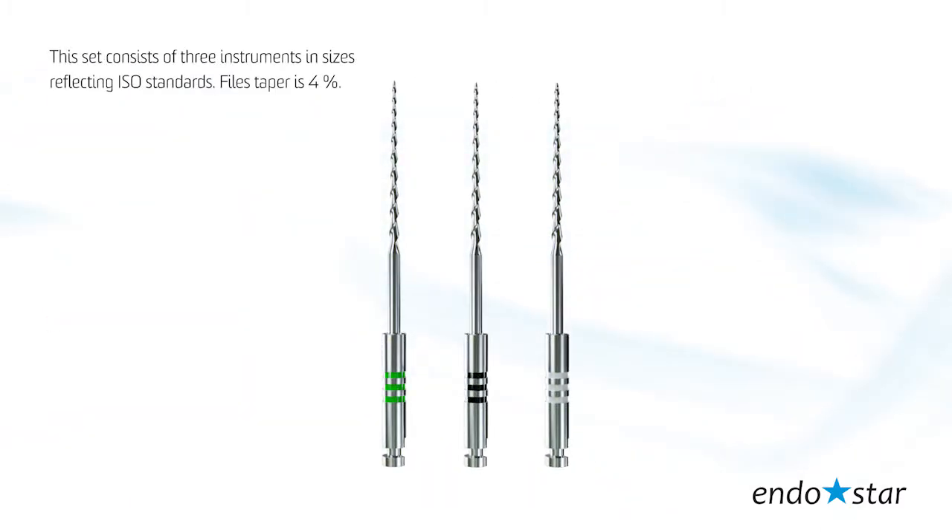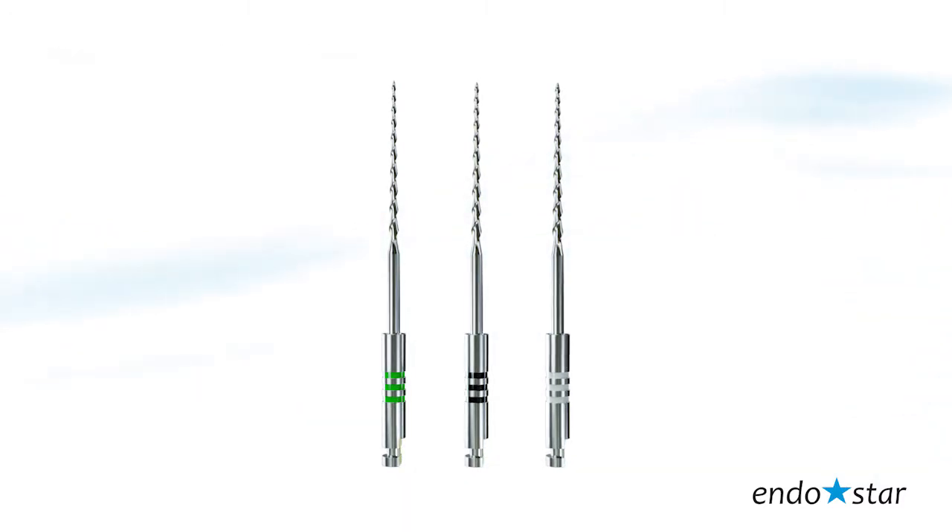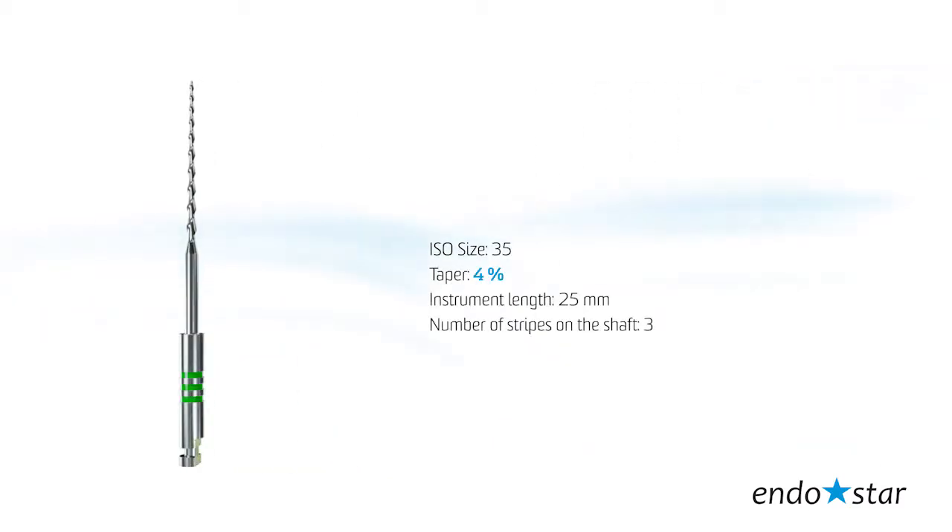This set consists of three instruments in sizes reflecting ISO standards. File number 1: the tip size reflects 35 according to ISO standards, taper 4, instrument length 25 mm.